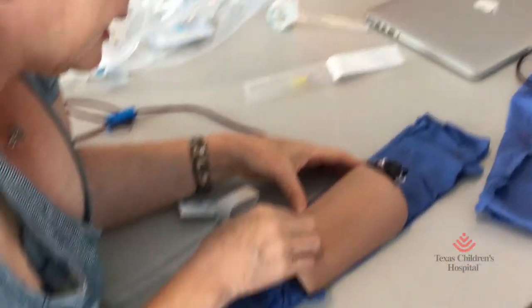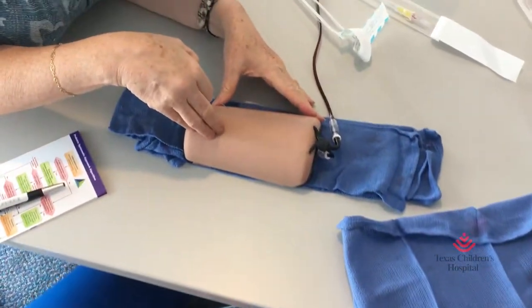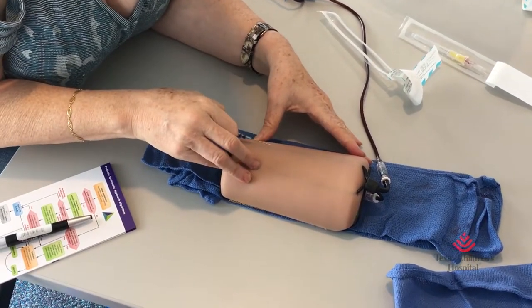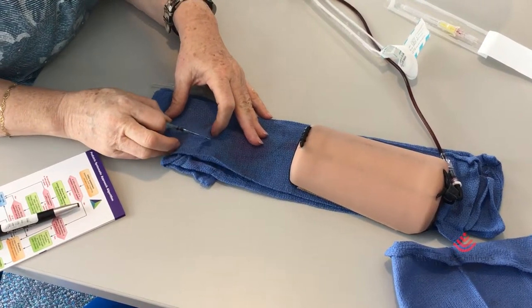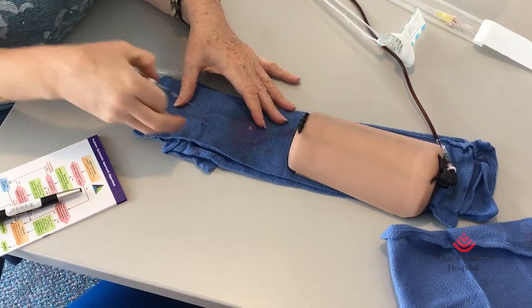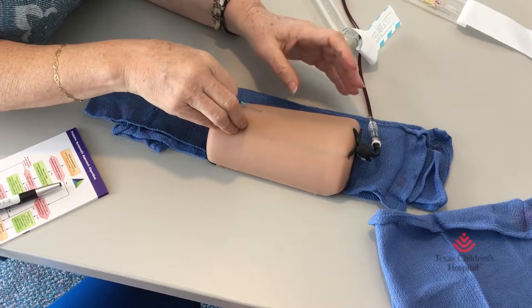The reason I say start at an angle is you'll see somebody trying to do this flat. What happens is — and I've seen it, that's why I try to teach people about it — I always say start at an angle, use that point for what it is, get in the vein. Sometimes if you try to go flat, you literally can shear the skin. So it's really important to use that point for what it's worth: get in, bam, get in the vein, then drop, and then do your sliding.